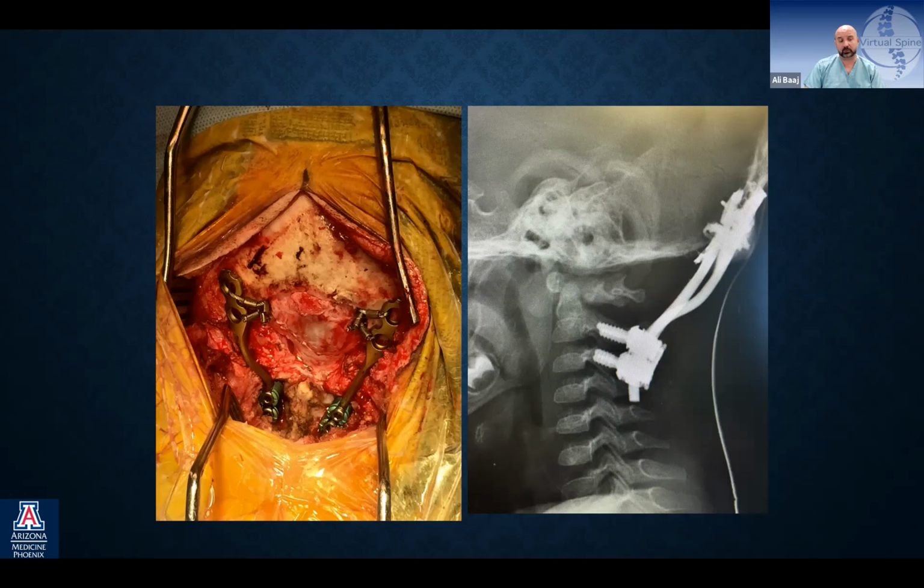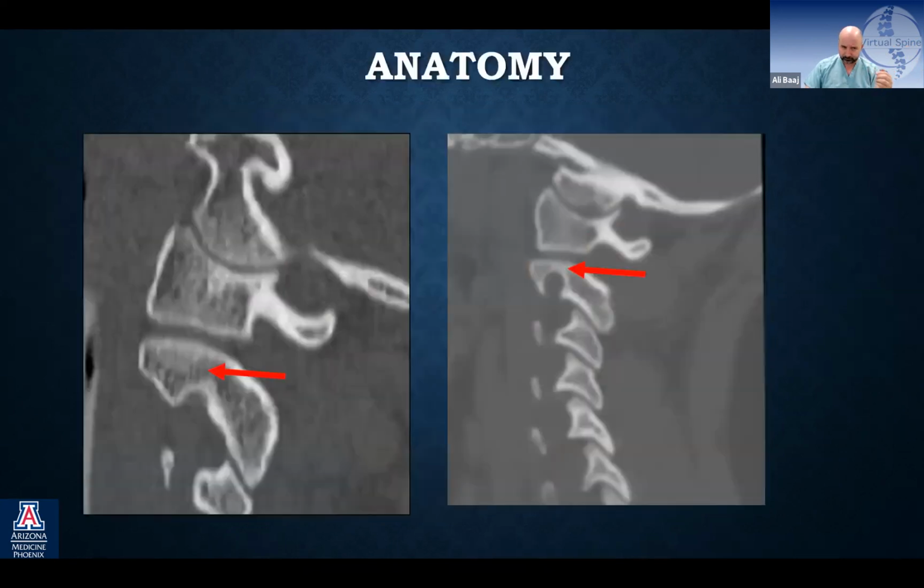And I'd rather utilize the occipital bone, whether if I can get a midline plate even high, that's fine. If not, you can go laterally. Obviously, laterally, you're not going to be able to put in long screws, but you can utilize Songer cables, you can utilize different types of fixation points. The point is, be versatile and have a lot of tools in your toolbox at the OC junction, because you never know what you're going to need that day. So be adept with wires, cables, as well as your traditional screws.